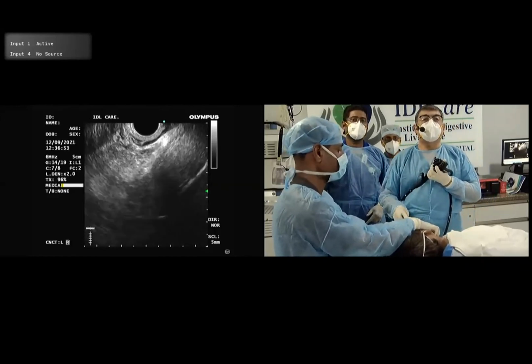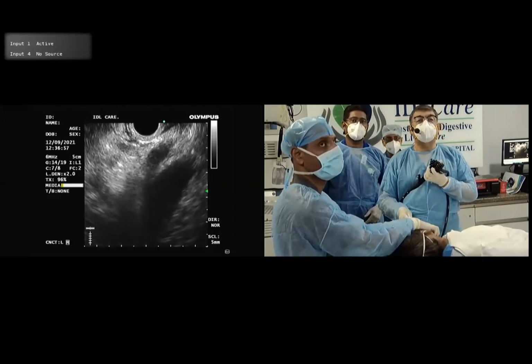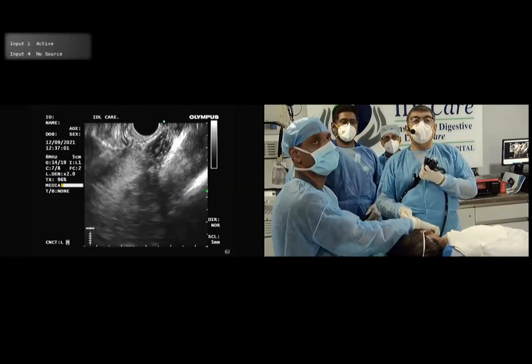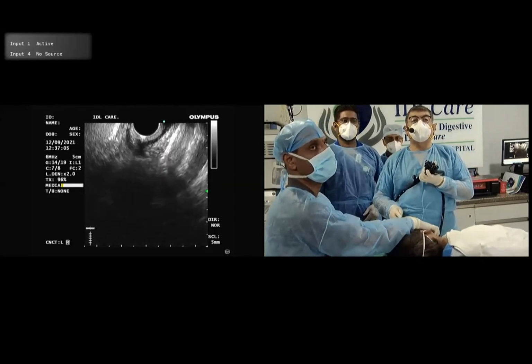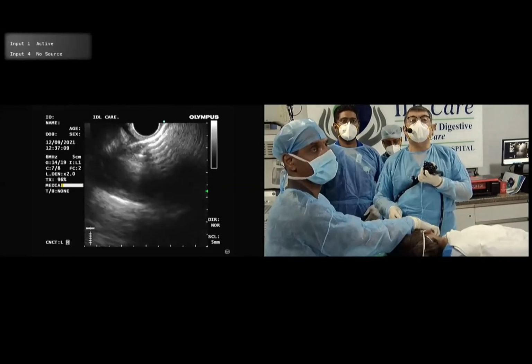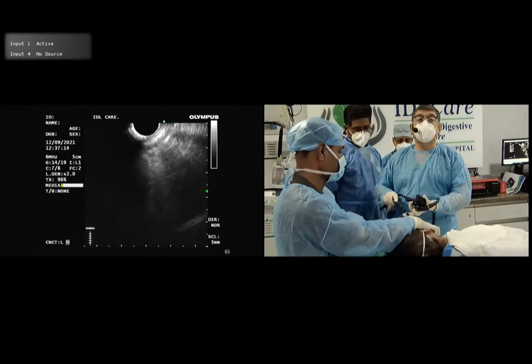Concentrate on focusing at the lesion. It should be in the right direction, and fanning is very, very useful. So you should fan the lesion, take from 4, 5 multiple areas. Don't take from the same area again and again, because then you create bleeding. You will get very, very good results, I can assure you.